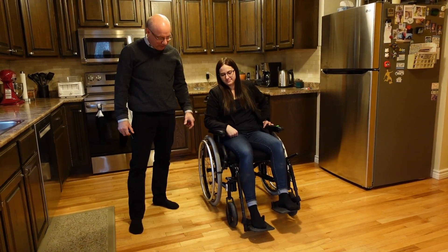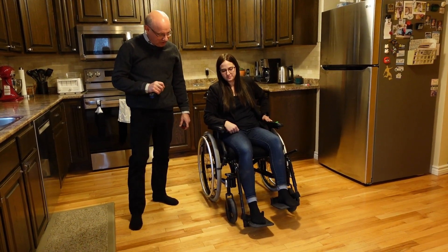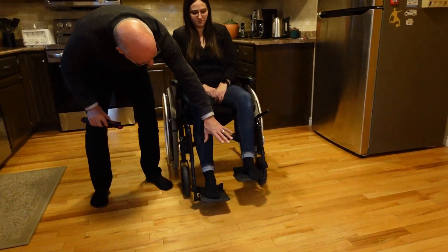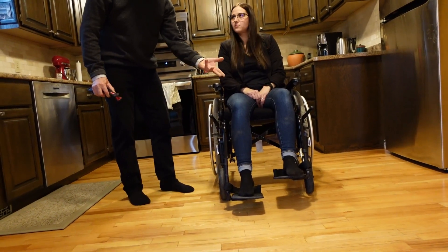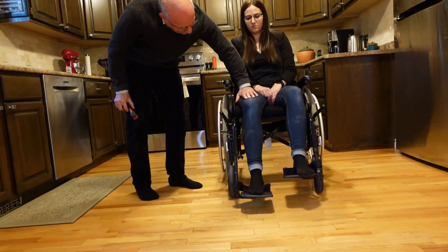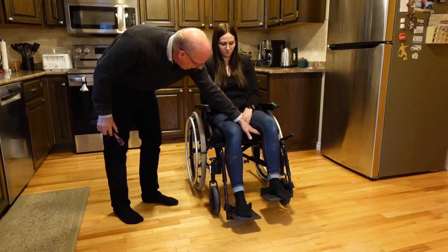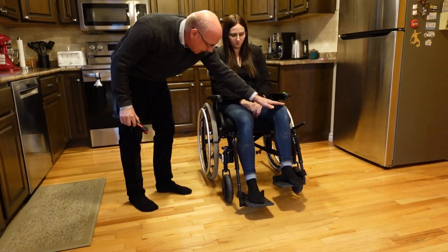So we just picked one of these chairs and you can see with adjusting footrests — this one's nice and level. But sometimes a wheelchair shows up and you've got the footrest so low it's sloping down. You want to get them level so there's not a lot of weight underneath. The legs are nice and level.